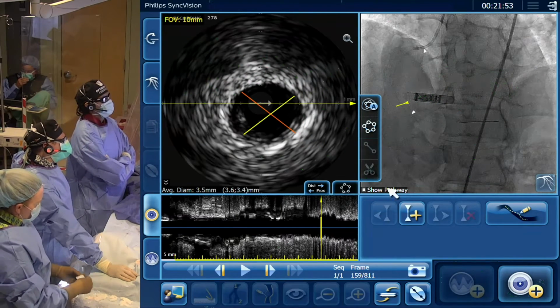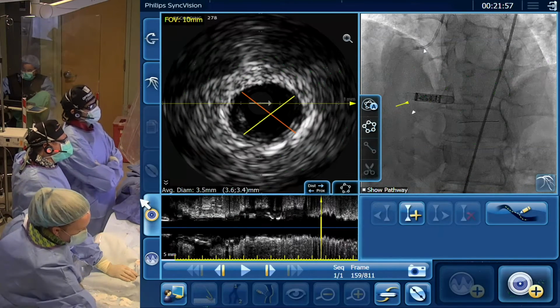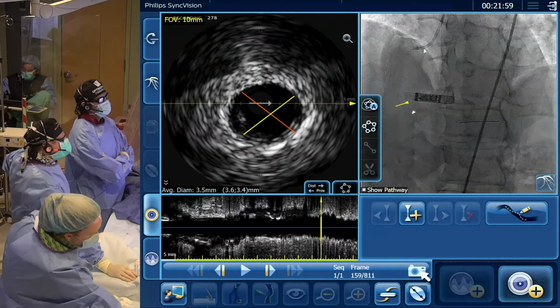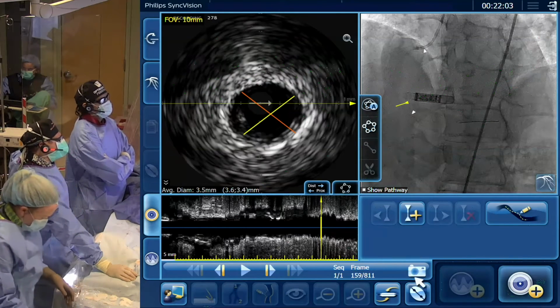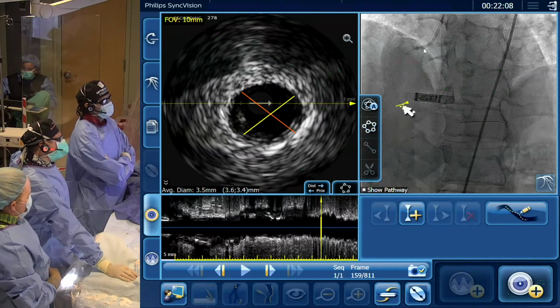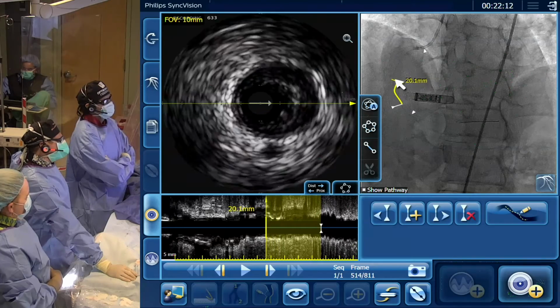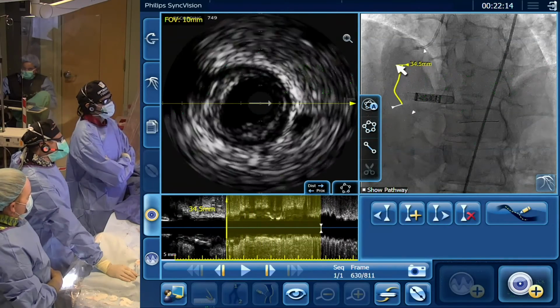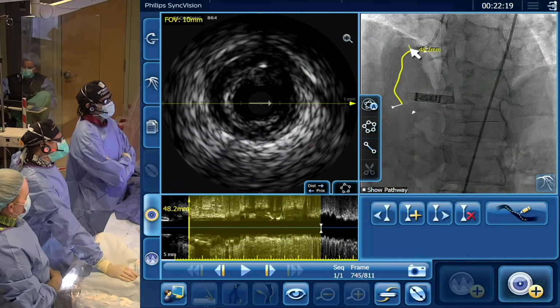Yeah. So let's take a 3.0. Good. So we'll take the mean of that and round down. That'll be right on 3.5, but I think this is a 20 megahertz IVUS, so we'll round down to 3.0. And then how long is this? It's going to be 38. Yeah. Keep going. It's going to be longer. So let's start with the 3.0 by 38, and then we'll use the second.